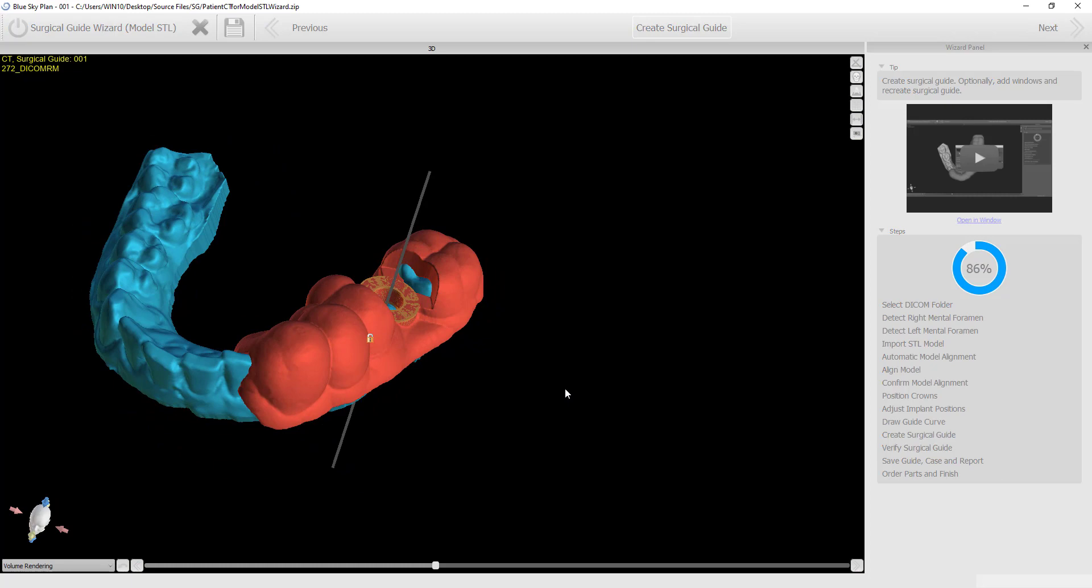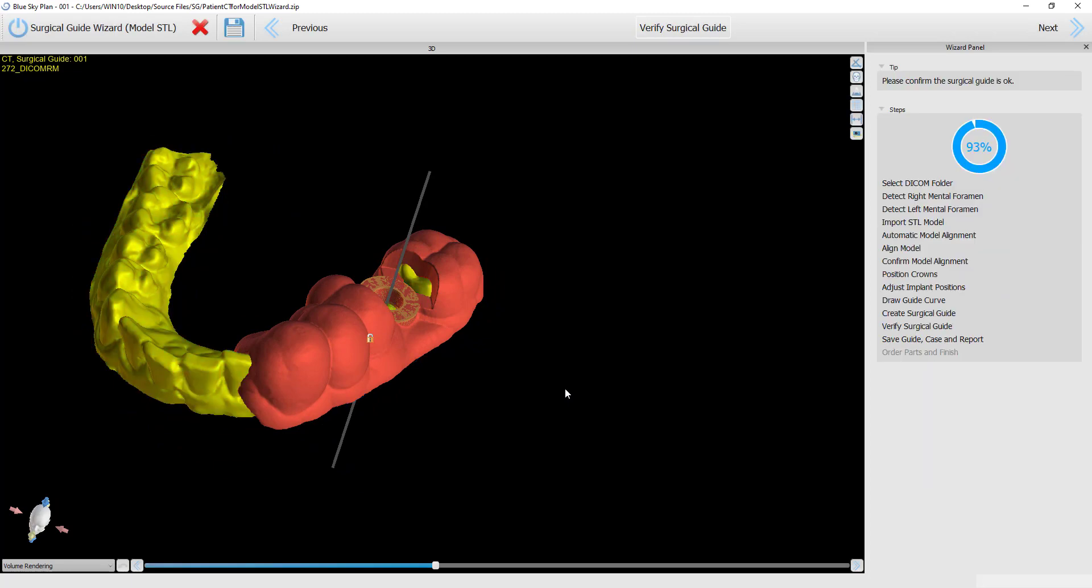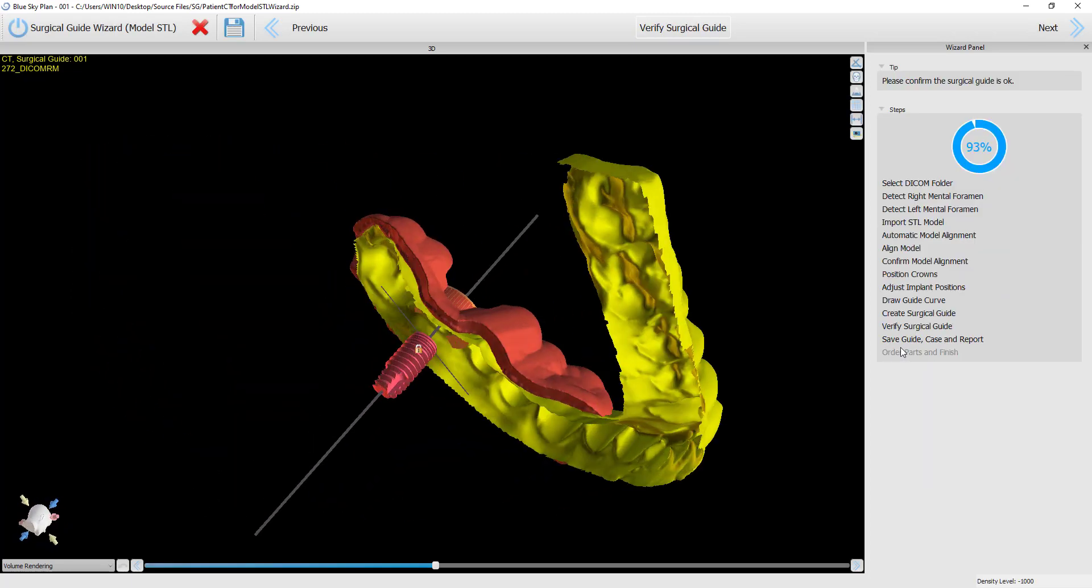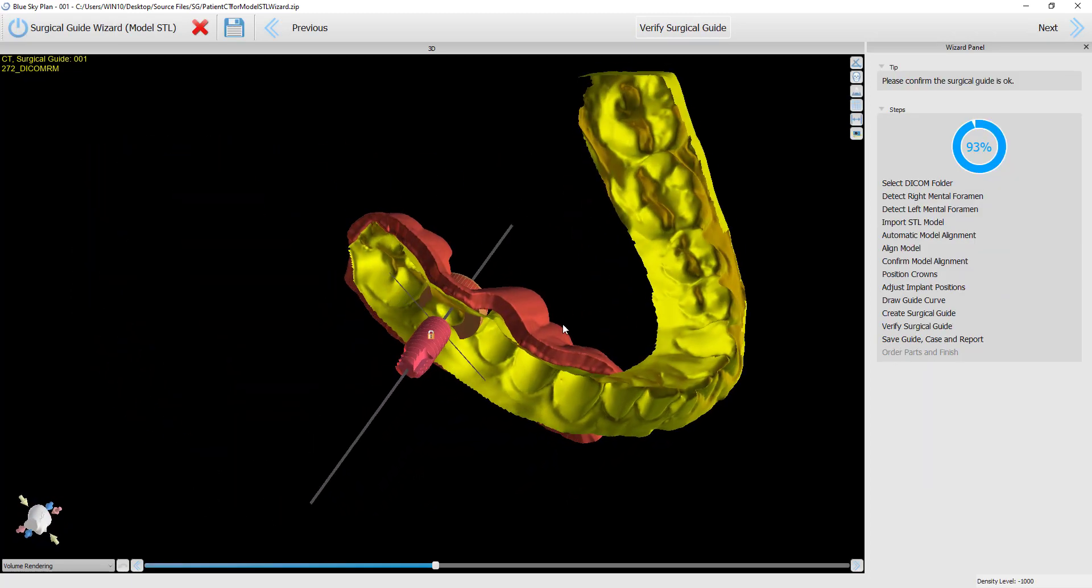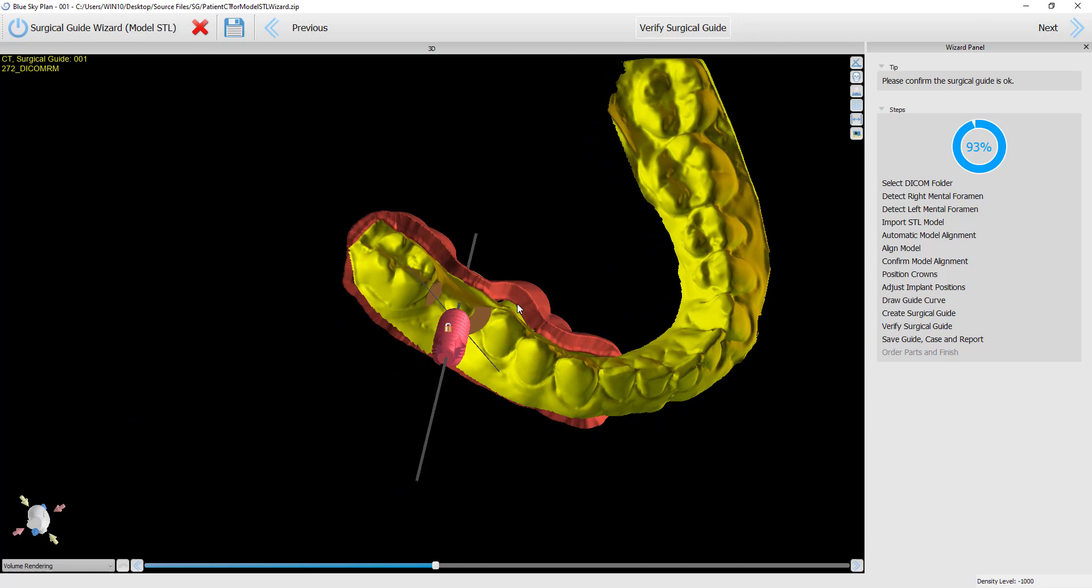Clicking next again shows the surgical guide on the original model, and we can see the spacing where the undercuts were removed.